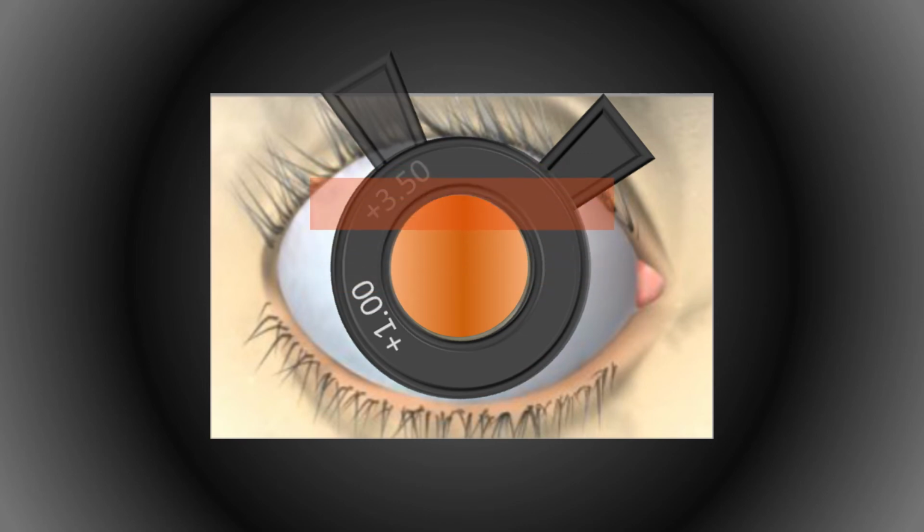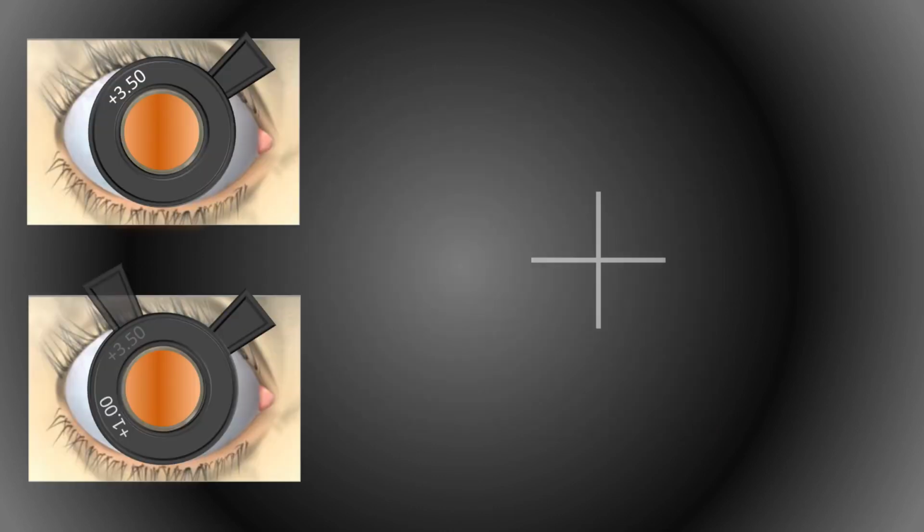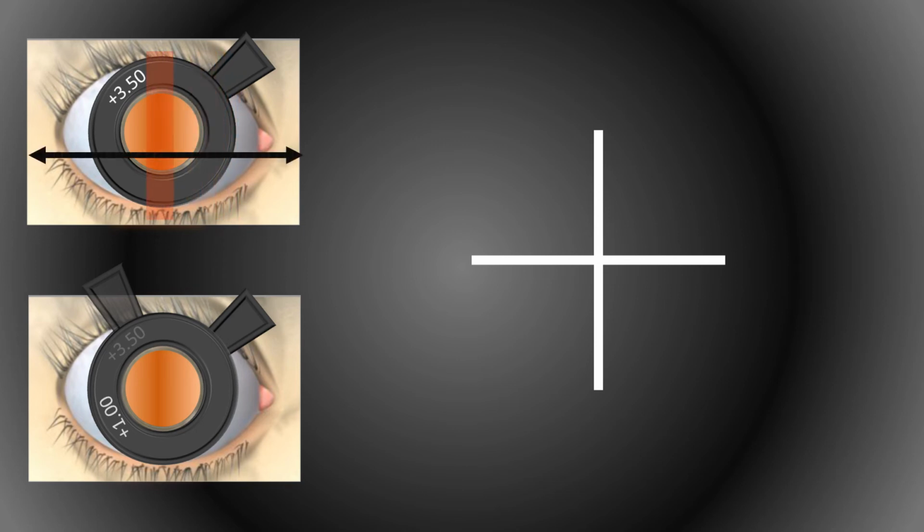Now I'll tell you how to make a power cross from these findings and how to record the findings in two principal meridians as a power cross. First, make a cross. When you place your streak vertically and sweep it from left to right or right to left, then you are actually neutralizing the horizontal meridian.